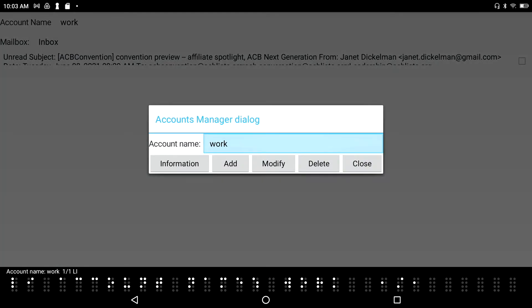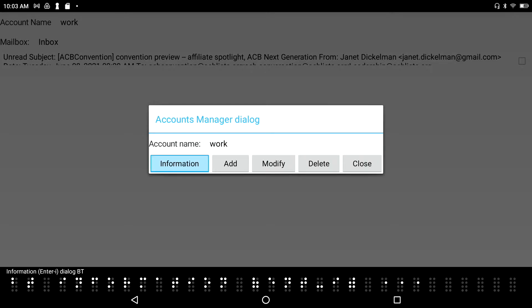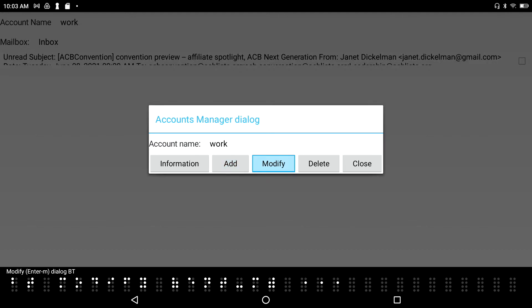In the Account Manager dialog, I can see I already have one account called Work. Tabbing through the buttons, I have: Information to view account details, Add to add a new account, Modify to change an existing account, and Delete to remove an account.